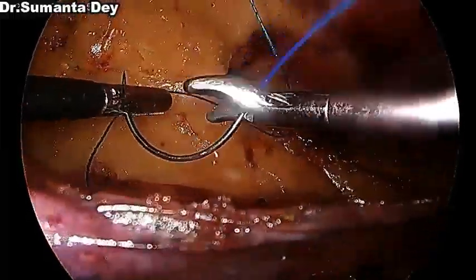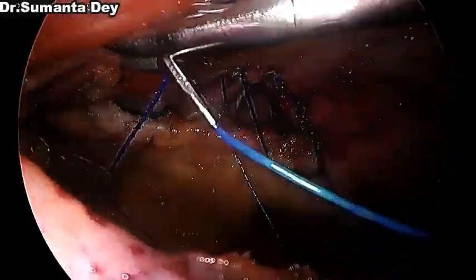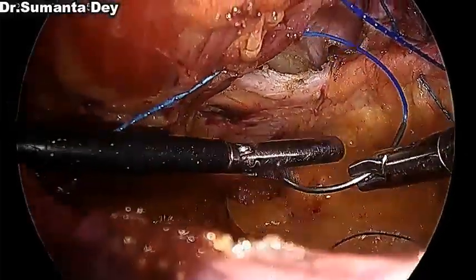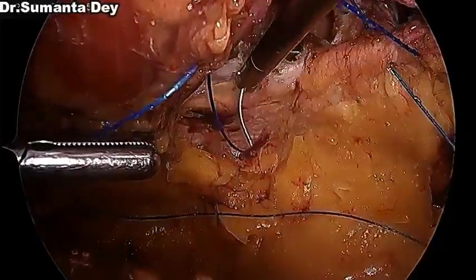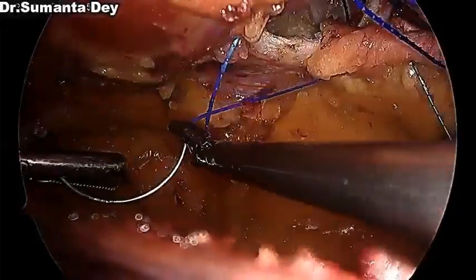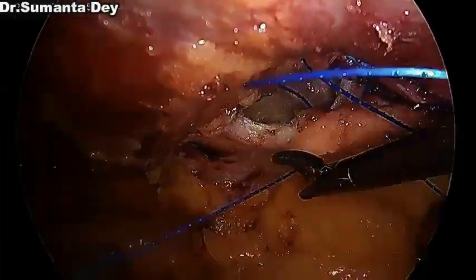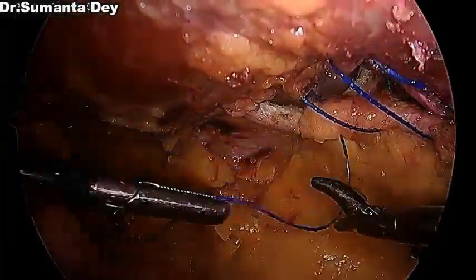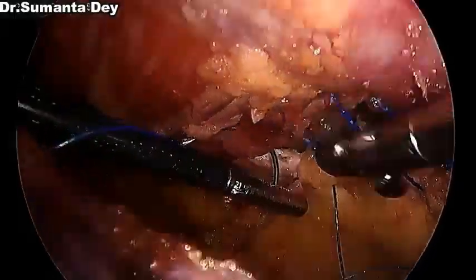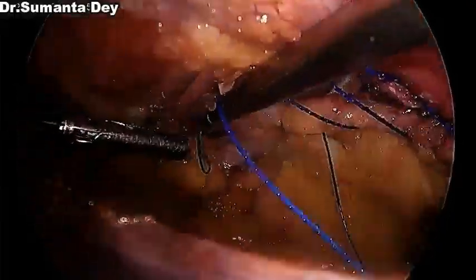Same as IPOM plus, where the difference between IPOM and IPOM plus is defect closure, here I call it TAPP plus. In a routine TAPP for groin hernias, we don't close the defect, but here we are closing the defect as we are doing an incisional hernia with the TAPP procedure. Gradually I am taking bites from the margins of the hernial defect, safeguarding the inferior epigastric vessel, which is adjacent to the right rectus muscle.